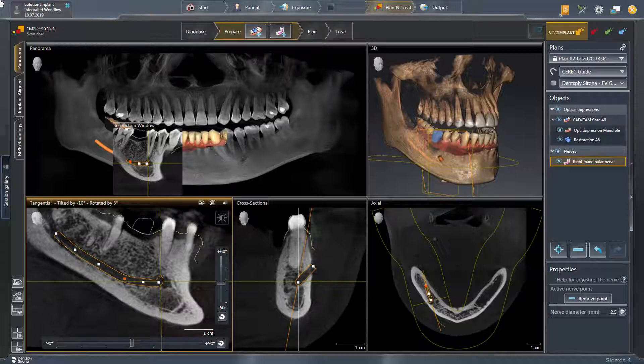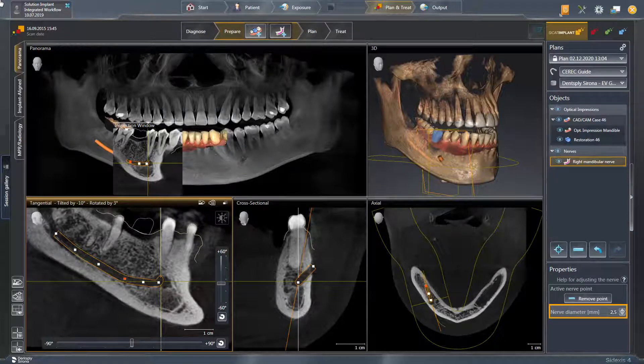Additionally, the nerve diameter can be adjusted by clicking the small up or down arrow.